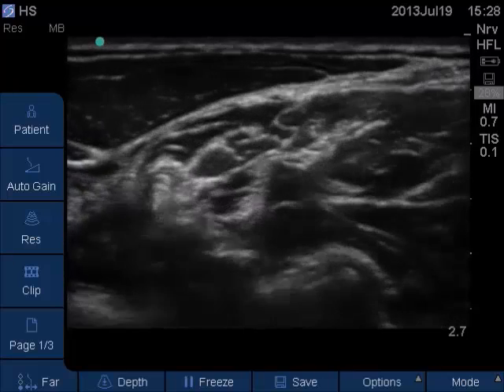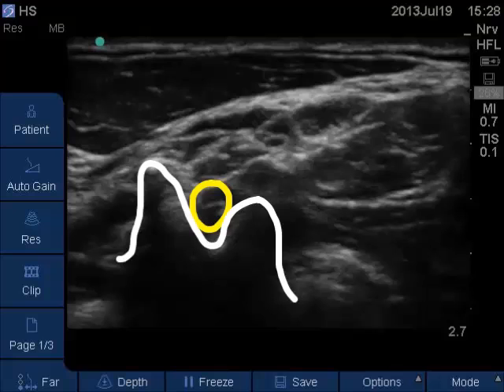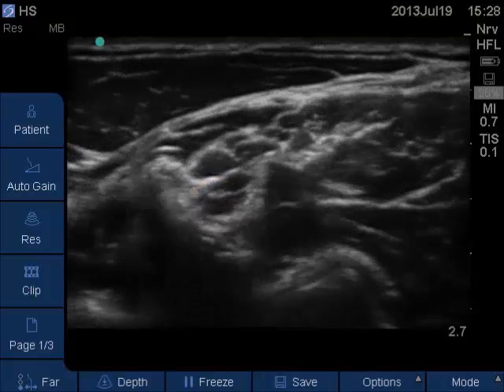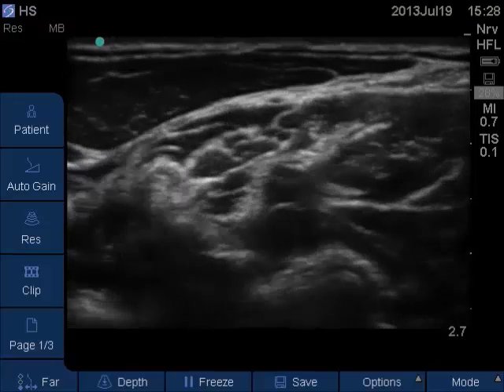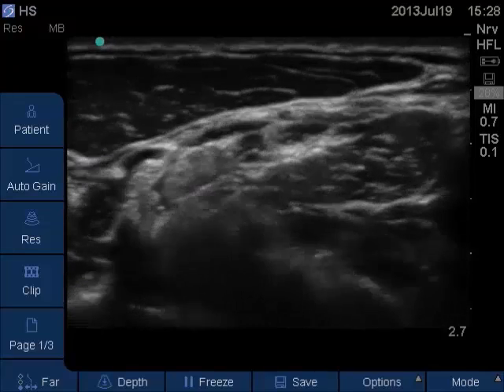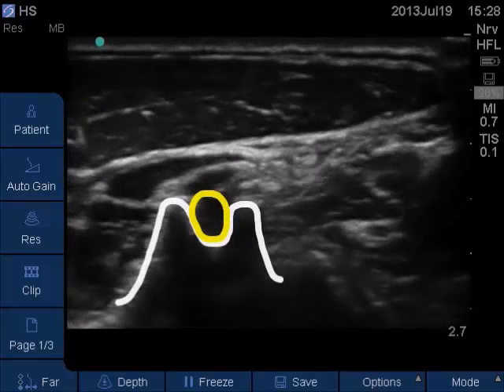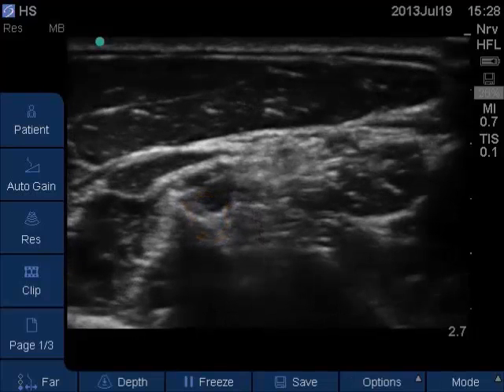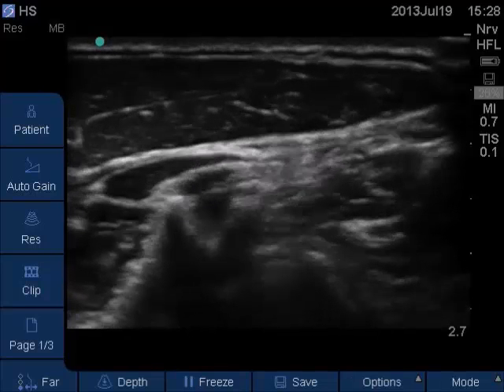As we move the ultrasound probe a bit more proximally, the C6 tubercle comes into view with the anterior being characteristically higher than the posterior tubercle, and therefore this has to be C6. As we move the probe even more proximally, two further tubercles come into view but these are of equal height, and therefore this has to be C5.